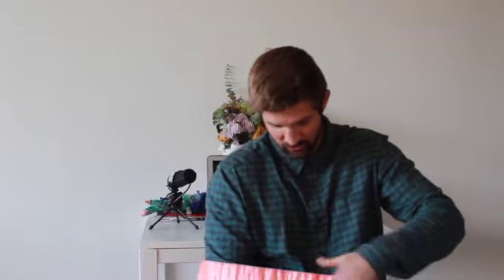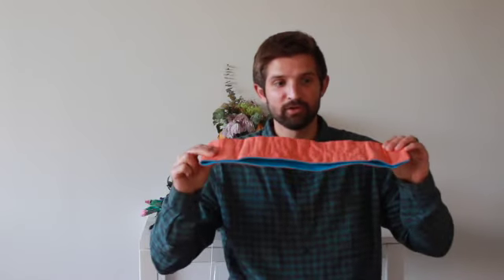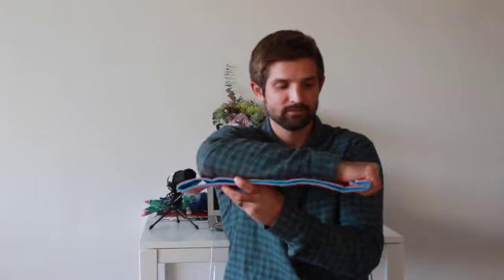Another thing often used by first responders are SAM splints. They come rolled up in a package and are pretty cheap. There are longer ones for an ankle, and they can be used for a sugar tong technique going above and below. I usually fold it over so it's extra strong, then roll it to make a little wrist grip, supporting above and below. We want to support the hand and radius and ulna to minimize movement where that injury is, so the blood clot can form and osteocells can start the healing process.